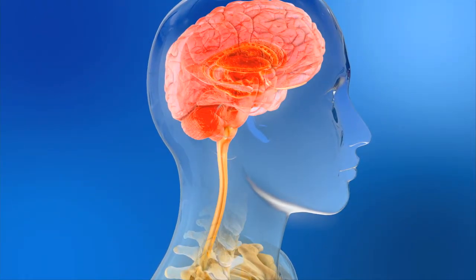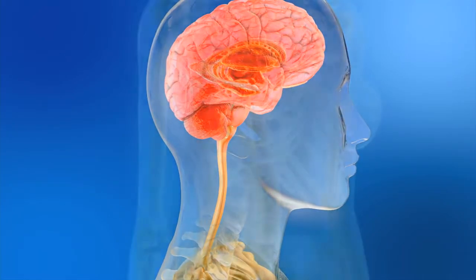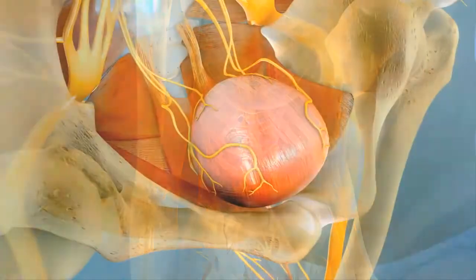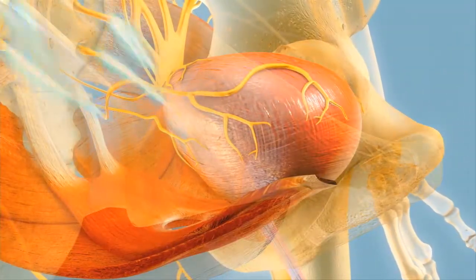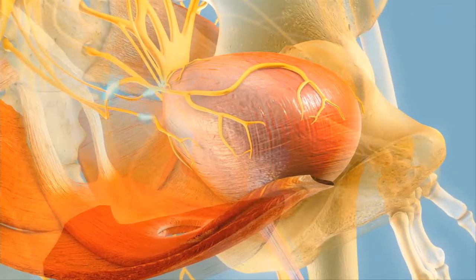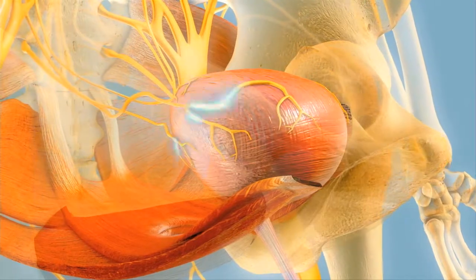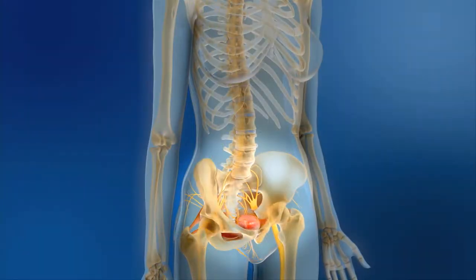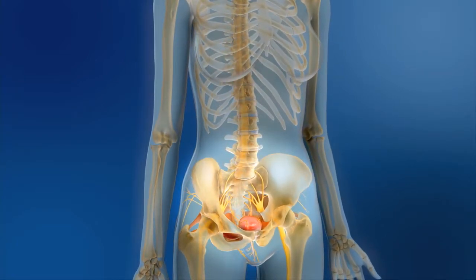In response to the full sensation, and at a socially appropriate moment, the descending motor or efferent brain pathways, which are under voluntary control, are activated by conscious thought. This causes the urethra and pelvic floor to relax and the bladder detrusor to contract, resulting in voluntary urine release. Dysfunction of the sensory and motor pathways alters the checks and balances that are critical to voluntary bladder control.